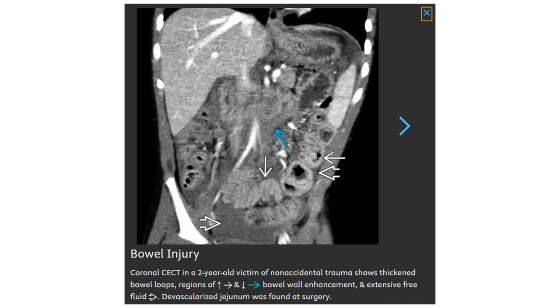Again, this is the contrast-enhanced CT in a two-year-old victim of non-accidental trauma, showing a lacerated bowel loop with a region of increased and decreased bowel enhancement and extensive free fluid. A devascularized jejunum was found at surgery.